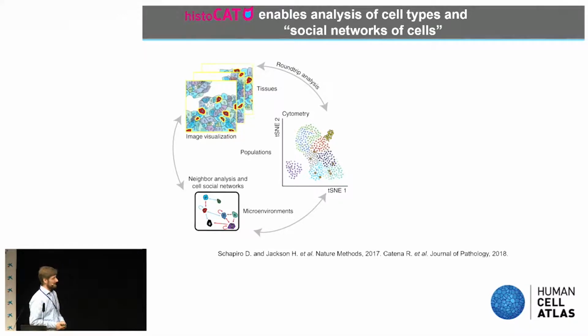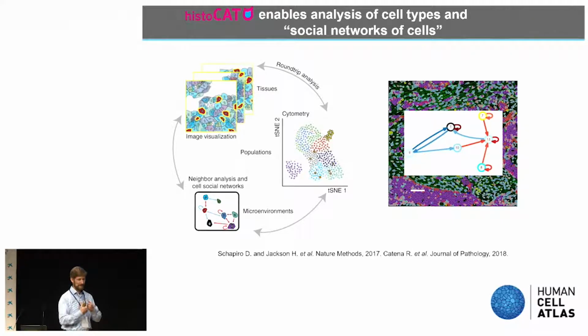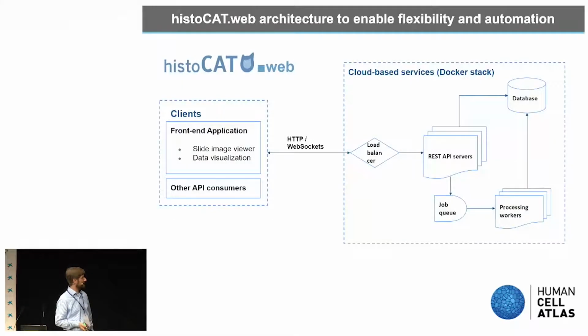As for the data analysis, I'm really excited to be here because there are lots of smart computational people that I hope in the future will greatly contribute to analyzing these data in a spatially resolved manner. And at the moment we do fairly simple analyses. We have a toolbox called HistoCAT where we can look at the images, we segment, we determine the cell phenotypes. Then we also implement an algorithm to determine the direct cell neighborhoods and cell-to-cell interactions. Then we can determine different areas, such as the tumor and the stroma. We can calculate distances and several other features. But I believe that's really very basic analyses that we are currently doing, given the nature of the data.